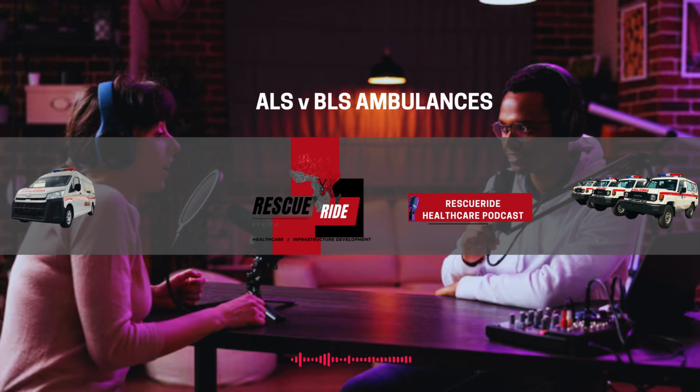Oh, definitely. You remember those AEDs we discussed earlier? Well, ALS ambulances take cardiac care a step further. They have portable monitor defibrillators that go beyond just shocking a heart back into rhythm. These devices can actually monitor the heart's electrical activity and deliver pacing impulses to help it beat regularly. So it's not just restarting a heart, but actually helping it to function properly. That's amazing. It sounds like they have a whole mini hospital on board those ALS ambulances.